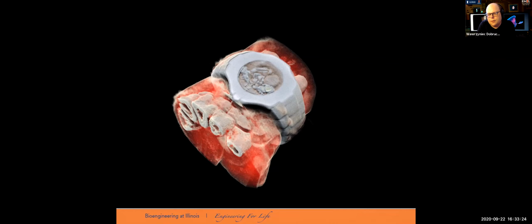So therefore, with the new technology, for example, if you are monitoring what new CT scanners are manufactured by the companies, one of the new directions is to reduce the exposure. Reducing exposure means that the time to acquire should be reduced, and also the energy, or the density of the energy, should be reduced. Another question is, do they have to adjust the energy for patients of different weights?